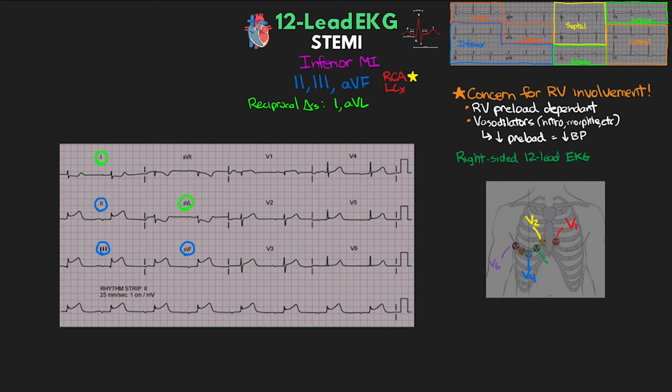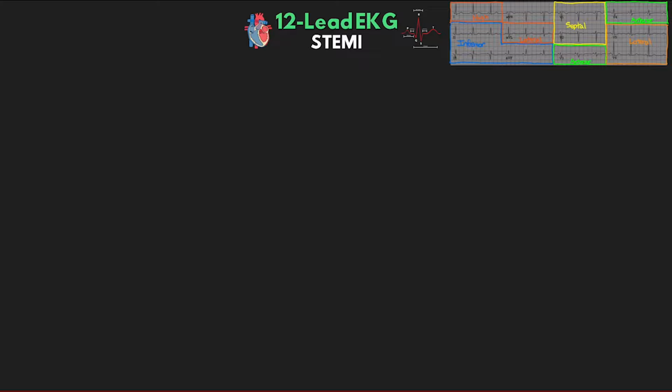And then V3, we want to put kind of diagonally in between V2 and V4. And then V5 is going to be in the middle of V4 and V6, again along that horizontal plane. So this is going to give us a view of the right ventricle and really help us identify any RV involvement and determine whether the patient should be considered for sublingual nitro or whether we also want to be concerned with, like, morphine administration as well.